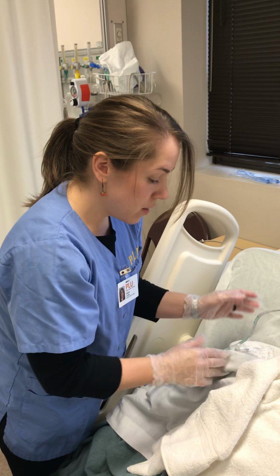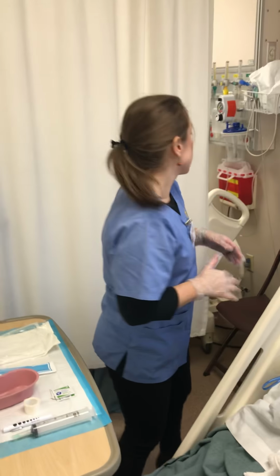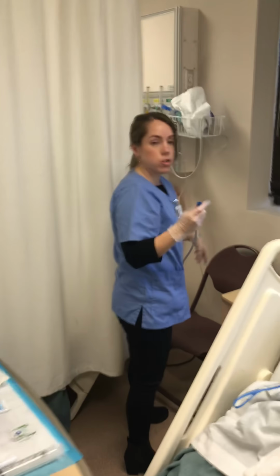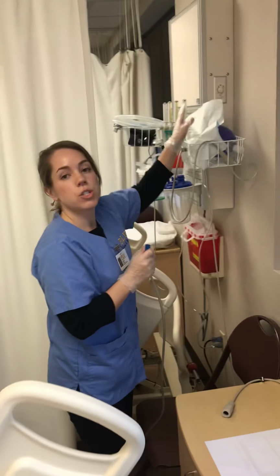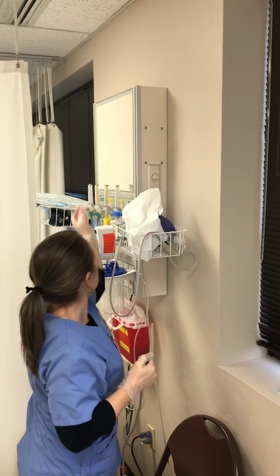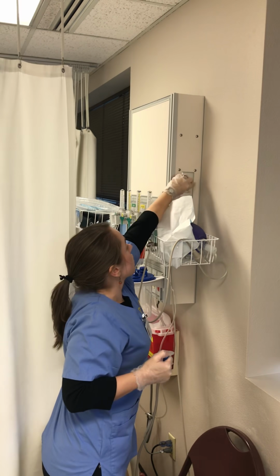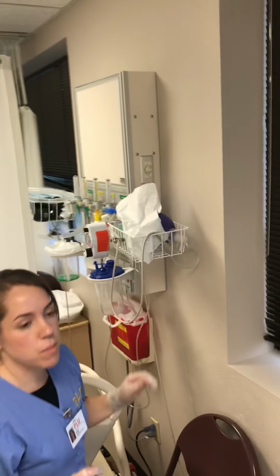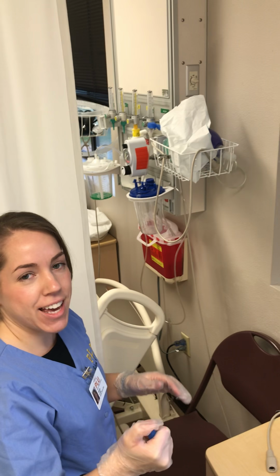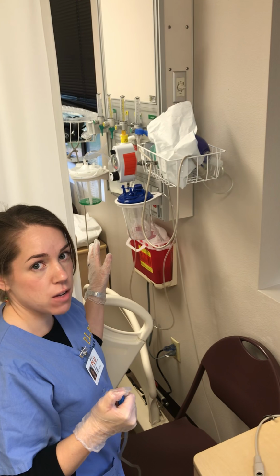Okay. And then what we'll do is we'll hook them up to suction. Put your head down. Going to grab the tube, turn the machine on. Swallow every time I push. And then for this, I'm on continuous, and I'm also making sure I don't bother any other patients. And I'm just making sure I have suction. I want it to be between 65 and 74.